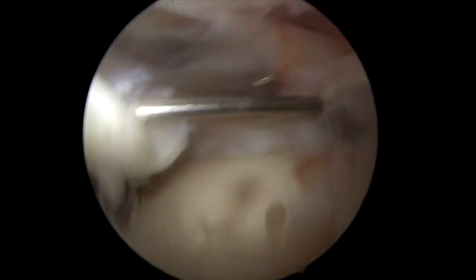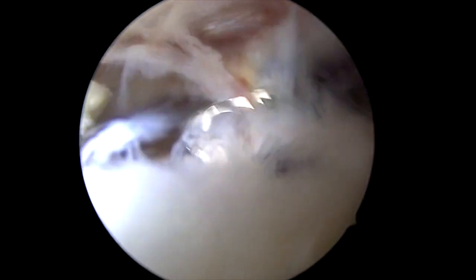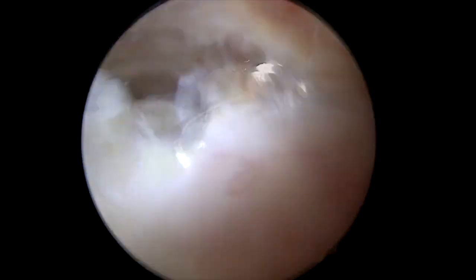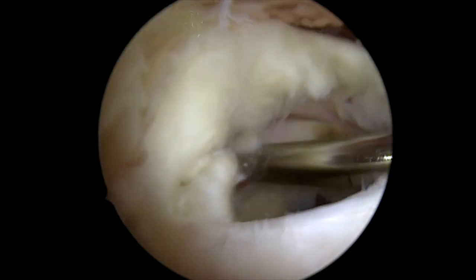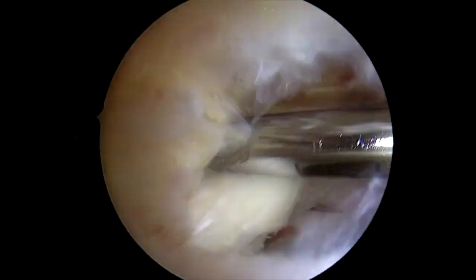First I make sure the spinal needle is going to be able to exactly get where I need to get, and then we begin our bursectomy. You want to be careful here to remove all the bursa because we're going to need that out of our way for later in the procedure. I really make sure I remove all of this posterior lateral stuff, because we're probably going to do a double row repair here. Remove all that posterior lateral bursa and make sure that we've got all of the frayed edges on the tendon removed.